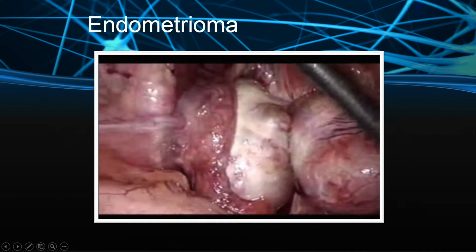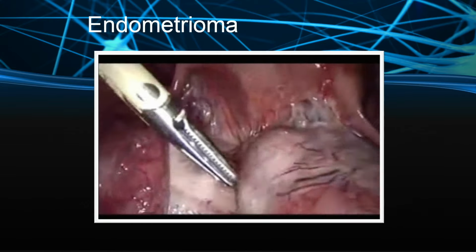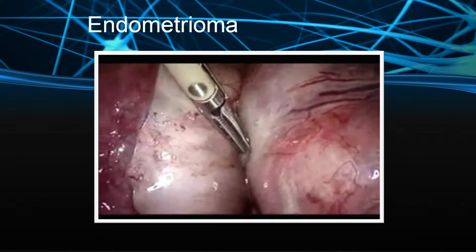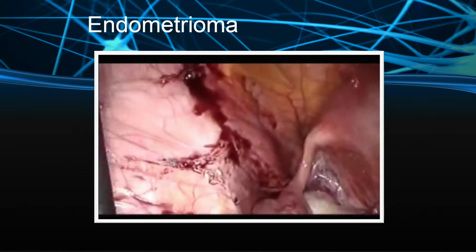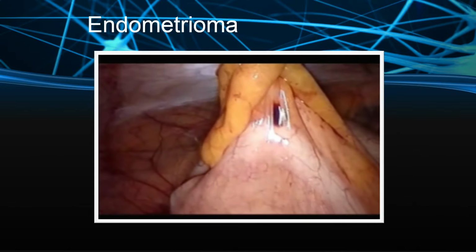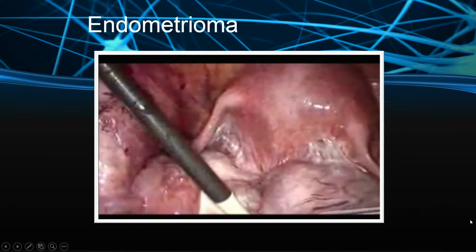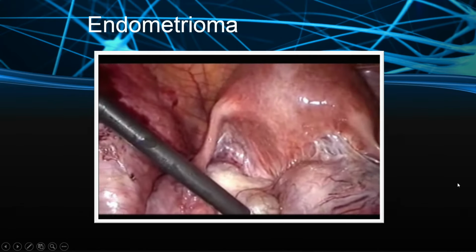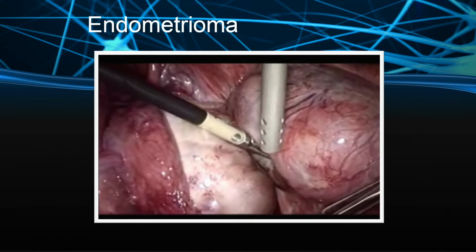Sometimes you have a very bad endometrioma in which both the ovaries are kissing each other, and the posterior wall of the uterus is completely adhered with the ovary, and the cul-de-sac everywhere is completely frozen. There is an adhesion of the sigmoid colon also to the anterior abdominal wall, but luckily the serosa was not damaged. So, you have to use a contralateral port position here, one suprapubic port and two on either side, and then you will try to separate both the ovaries first.